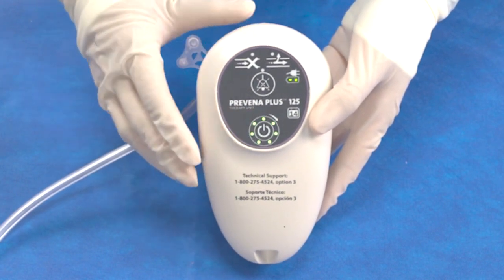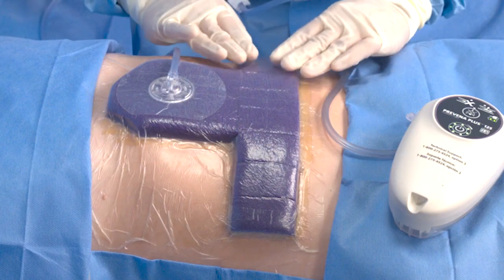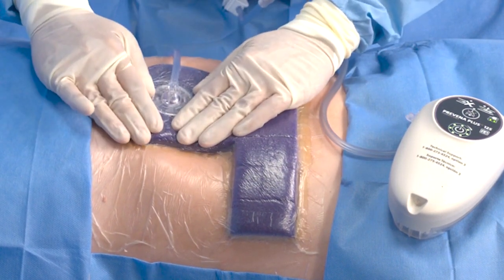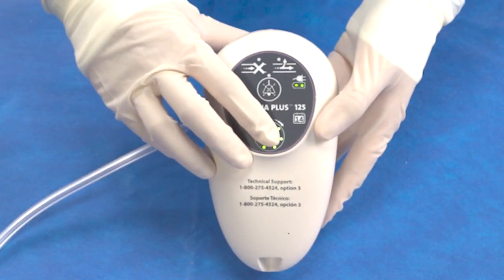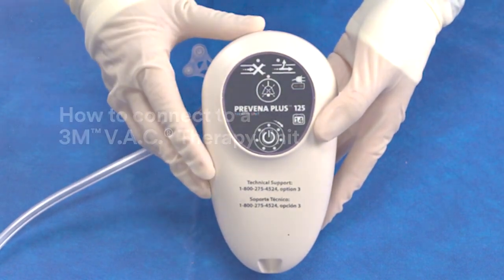The green lights on the front of the unit will illuminate, indicating that therapy is on. With therapy on, be sure to assess the dressing to ensure integrity of the seal. The dressing should have a wrinkled appearance, and the foam bolster should be compressed. To interrupt therapy or turn the unit off, press and hold the center of the on-off button for 3 seconds.